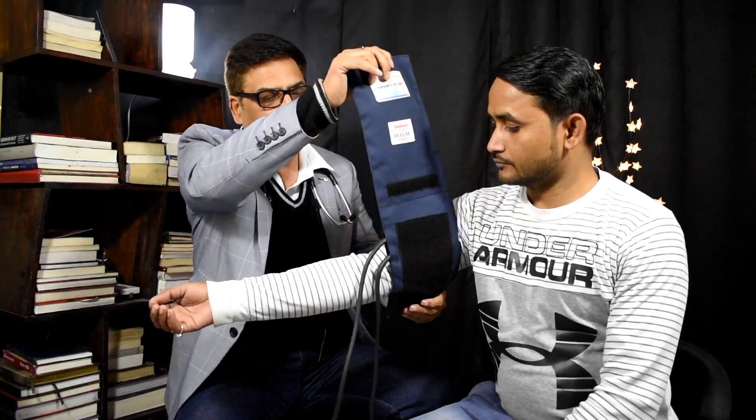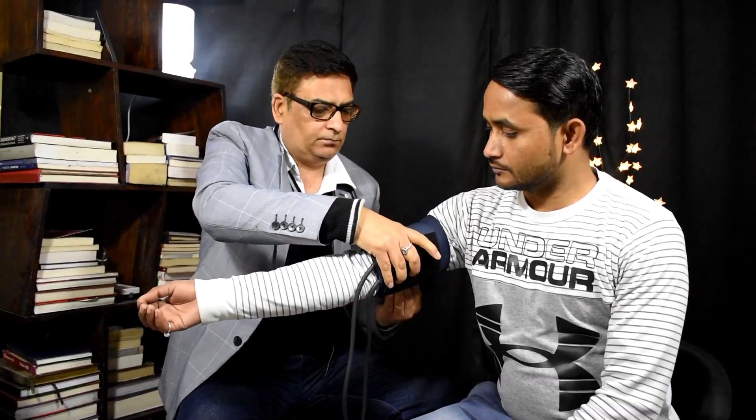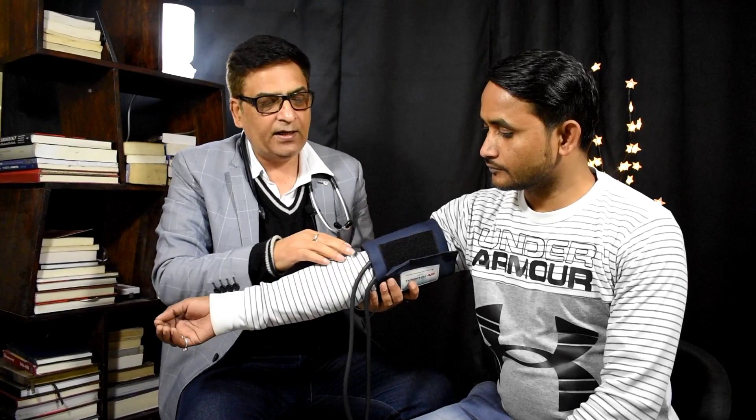Aur doosri baat — yeh jo wire hai, yeh tube hai, yeh andar ki taraf rehni chahiye, yaani is side mein — bahar ki taraf nahi. Main aapko baadh mein dikhata hoon, tab aapko pata chalega. Dekiye — maine aise baandh diya hai, yeh andar ki taraf hai, inside, is side mein. Isko bahar ki taraf nahi rakhna. Aur maine do ungali upar baandha hai elbow se.